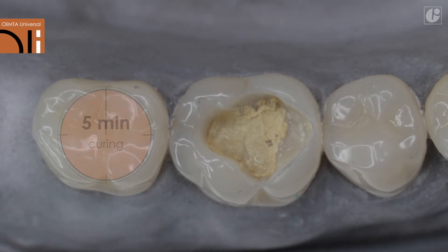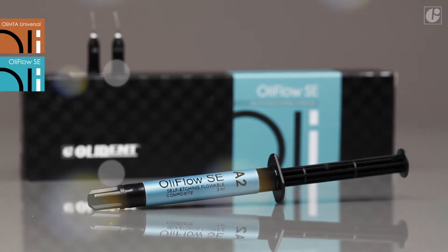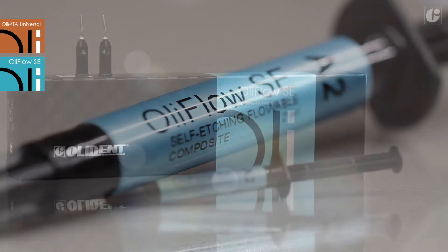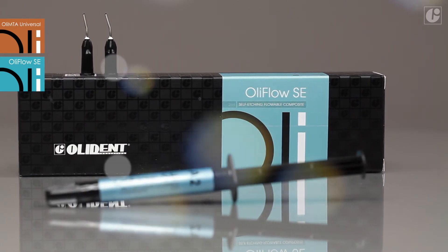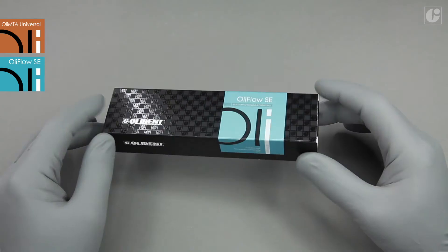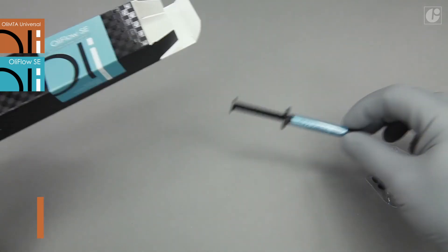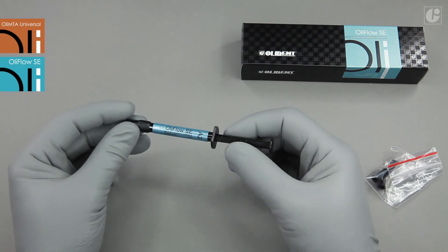After five minutes, you can move on to the next step — for example, covering OliMTA Universal with a flowable composite material. OliFlow SE will be used to reduce the duration of the procedure. It is a self-edging and self-adhesing flowable composite material that significantly improves everyday work. OliFlow SE packaging contains a two milliliter syringe and safe tip application tips.